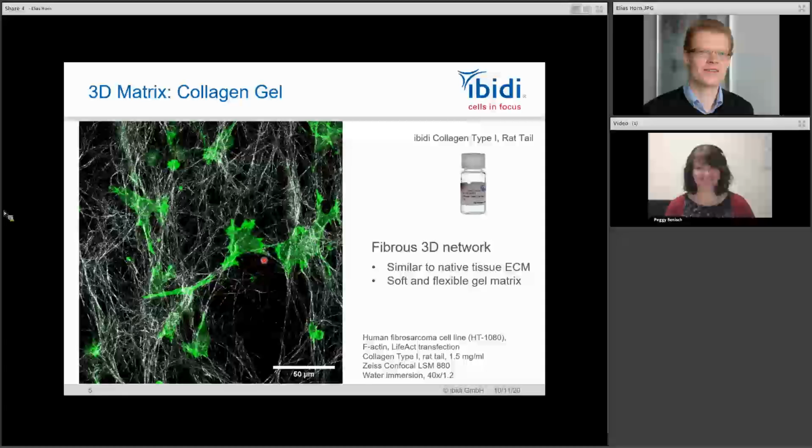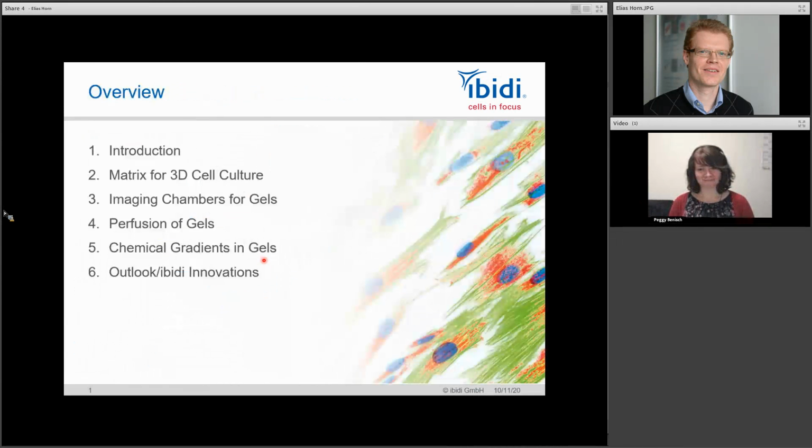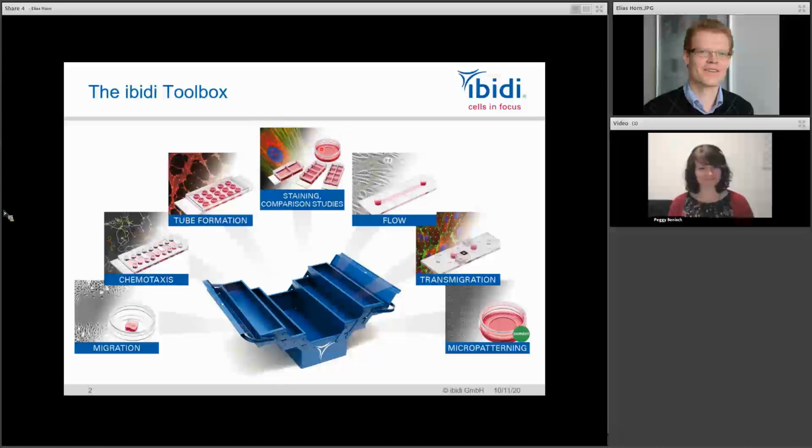Yeah, bigger vessels have more capacity for more gel and more cells. We very much focus on the imaging output, but as an idea, our dishes, what I have shown you here, do have a large inner imaging area, which is 21 or 22 millimeters in diameter and 1 millimeter in height.